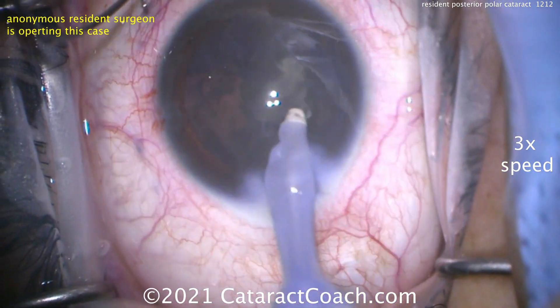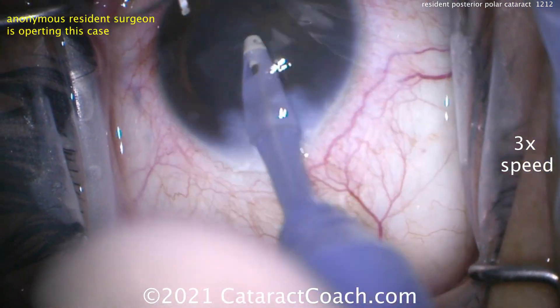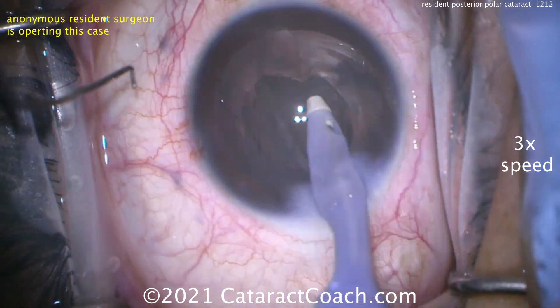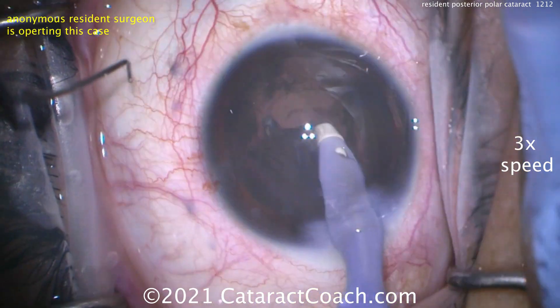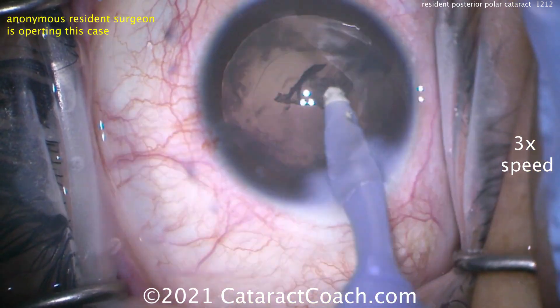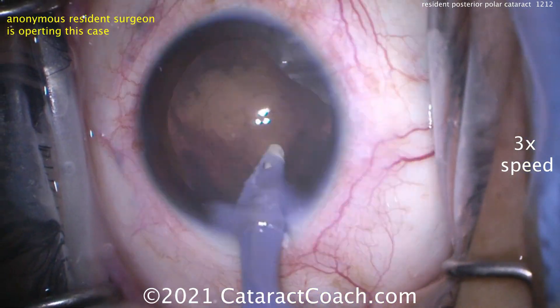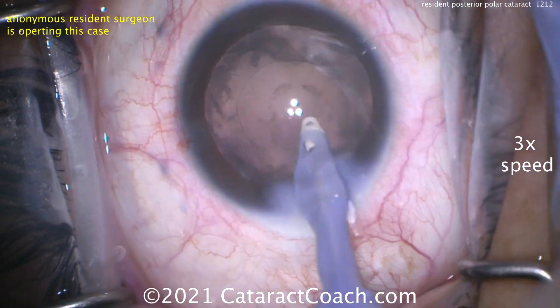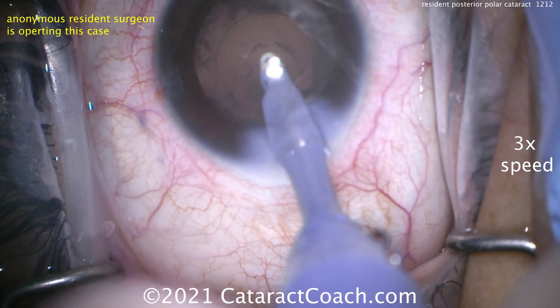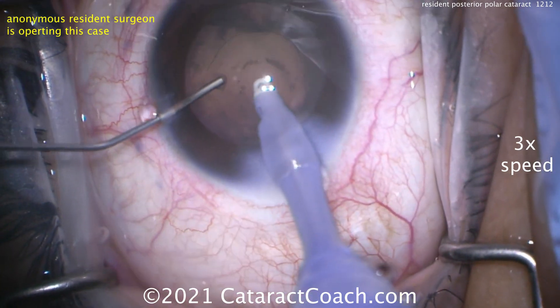Using this visco-dissection technique and other techniques — we've featured at least 10 different posterior polar videos on CataractCoach.com. If you haven't studied them, you owe it to your patients and to yourself to go to CataractCoach.com and search for 'polar.' We've been able to accomplish probably about a 1 in 30 risk of posterior capsule rupture — ten times better than the old historic 1 in 3 risk. The lens is cleaned up nicely. Now go inside and take out this cortex.